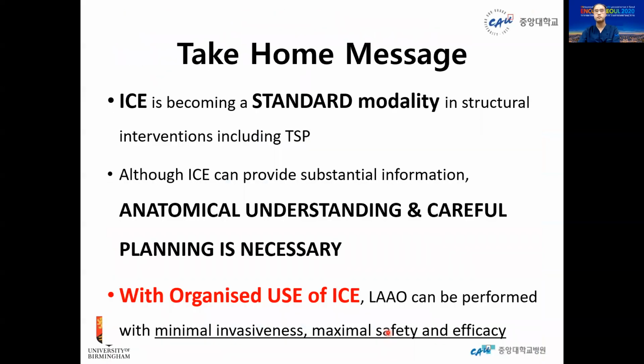Ladies and gentlemen, this is my conclusion. ICE is becoming a standard modality in structural intervention, whether or not it includes transseptal puncture. Although ICE can provide substantial information, anatomical understanding and careful procedure planning are necessary and critical to procedural success. With organized use of ICE, appendage occlusion can be performed with minimal invasiveness and maximal safety and efficacy.